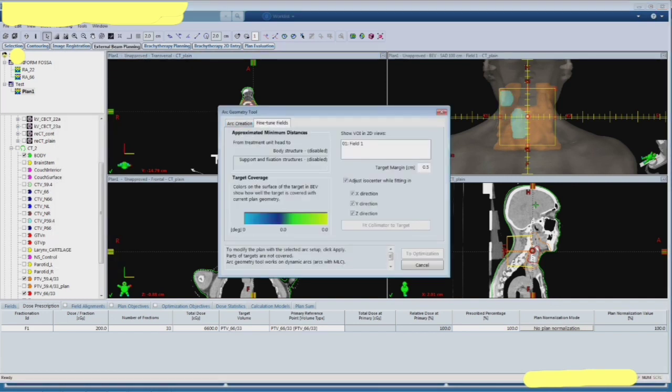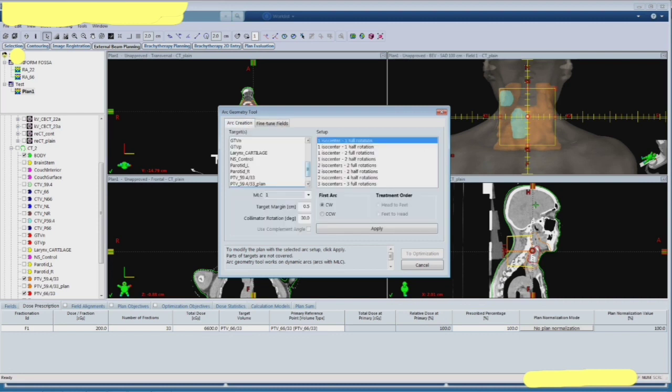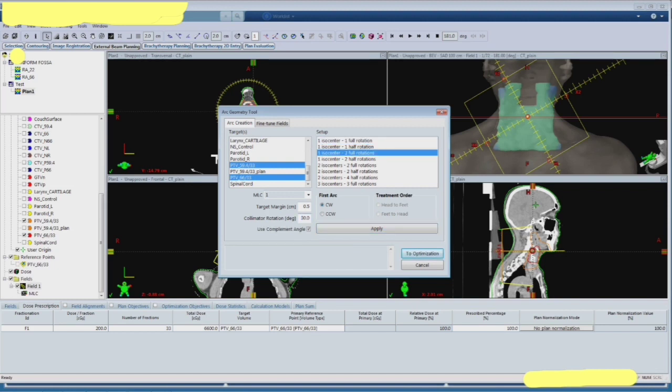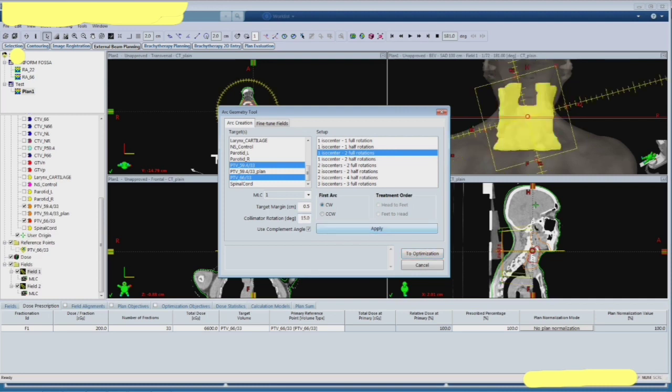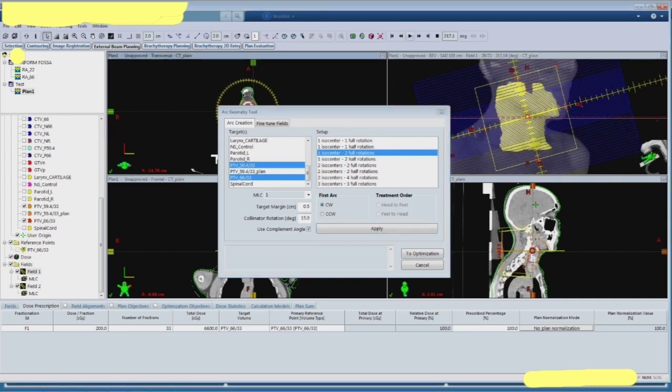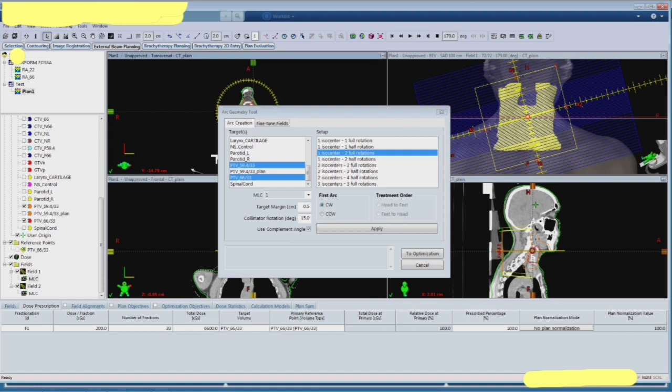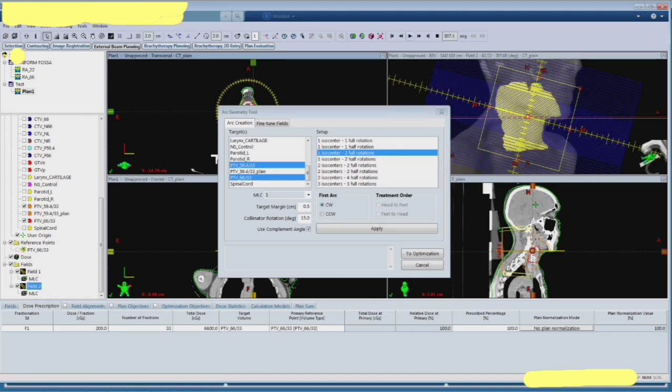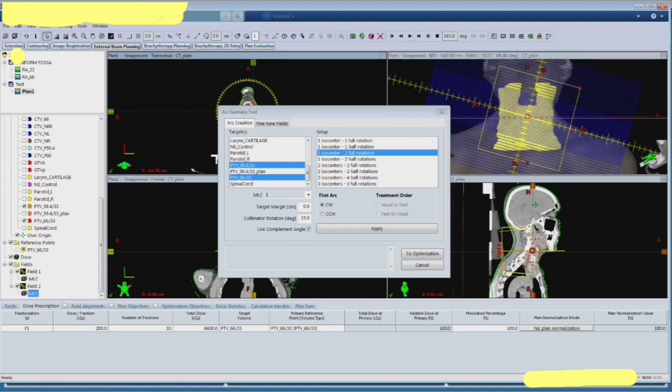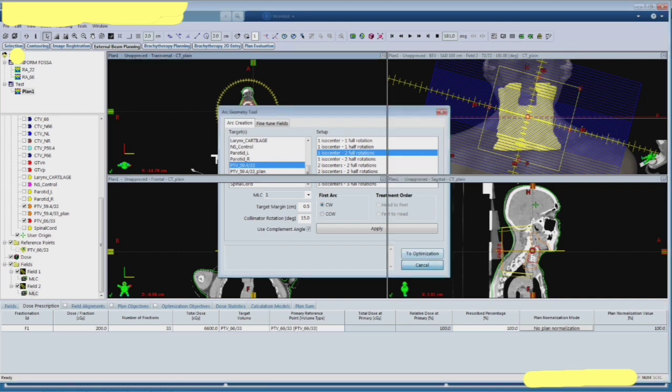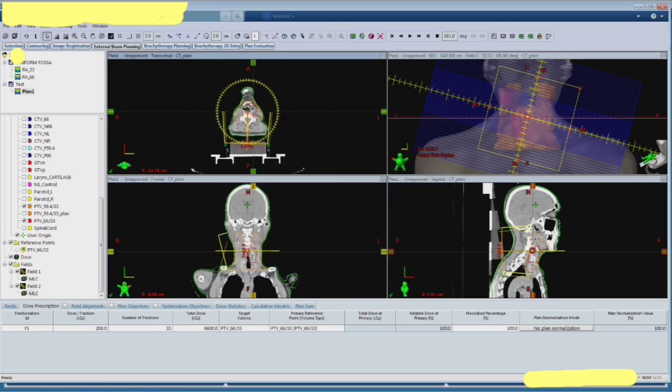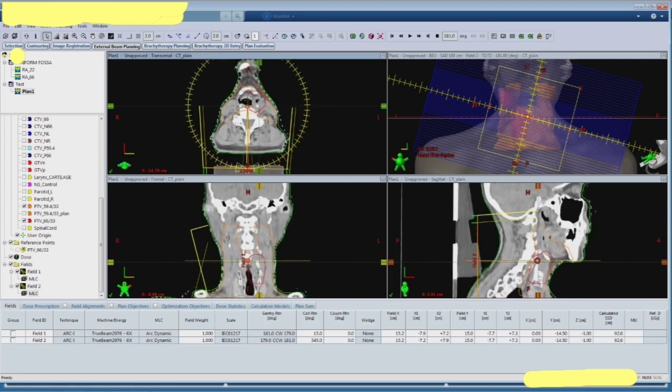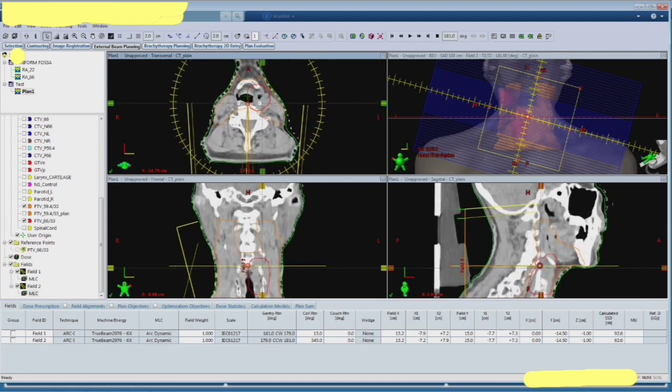Choose the targets that you have planned and that's going to show a different color in the BEV. You can change the color in the angle and then see how it looks in both beams. And even check the depth.